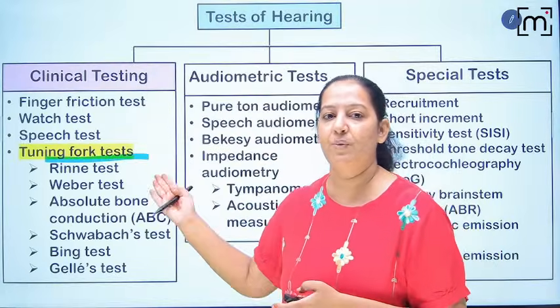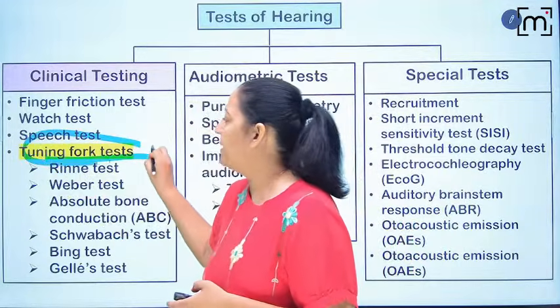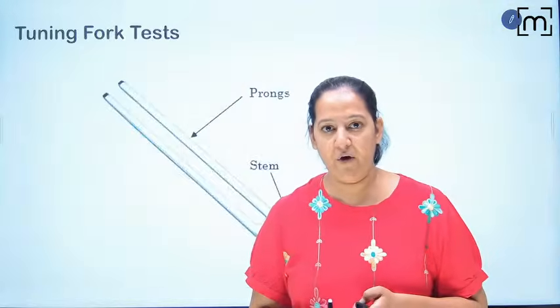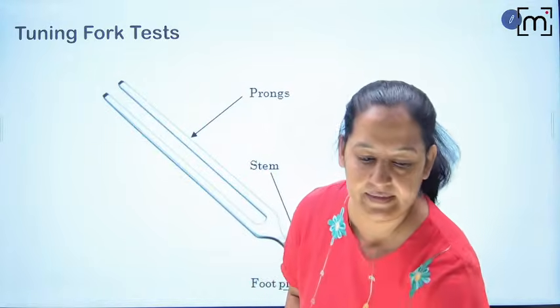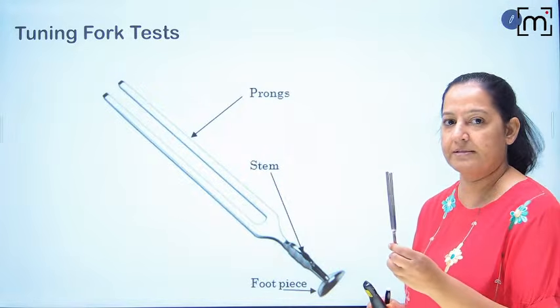Before I start the tuning fork tests, all 6 I will teach you. Let me tell you some basic things regarding the tuning fork. Have you seen a tuning fork? This is a tuning fork. I'm having some with me. You can see this is a tuning fork.